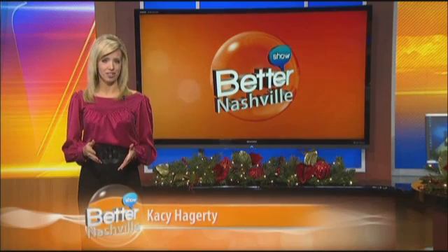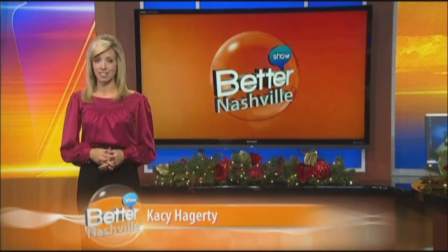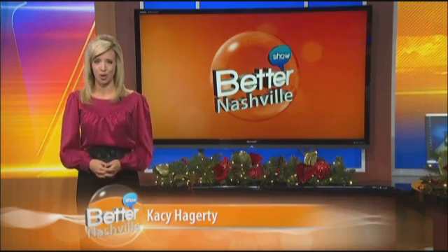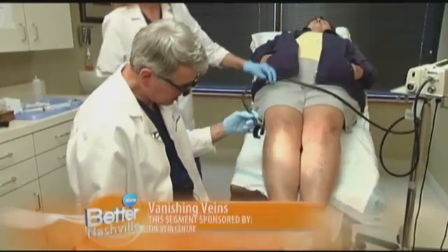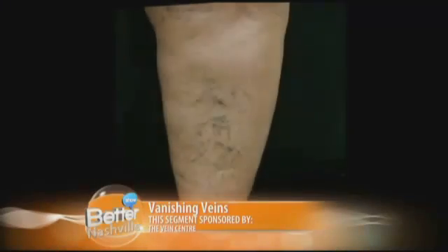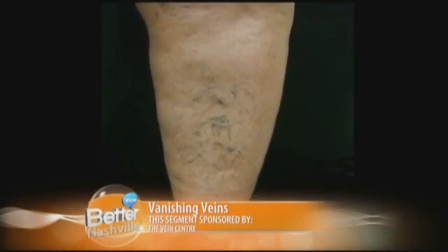Surgeons at the Vein Center are showing us how easily veins can vanish by giving us an inside look at a sclerotherapy treatment. Here's Christy with more. This is Miss Heike Smith. She has a bad problem with some varicose veins, or actually spider veins, and with some minor varicosities below them.